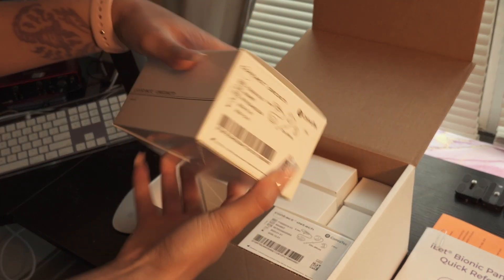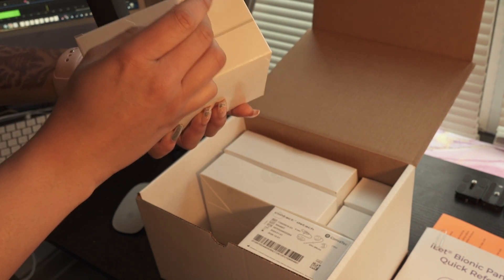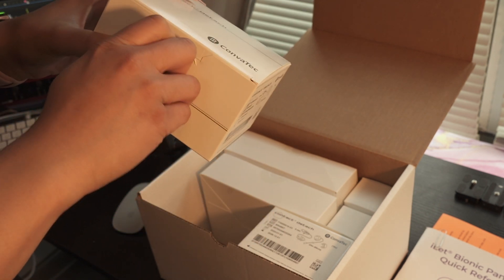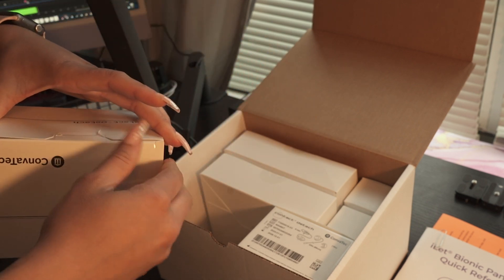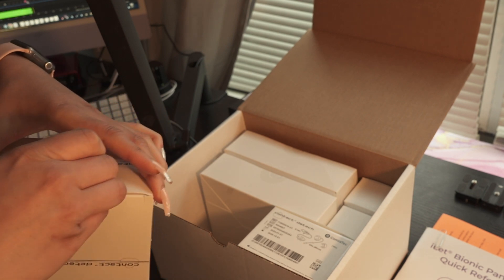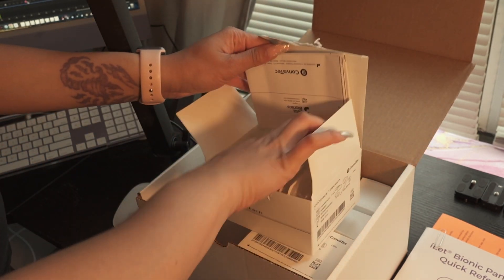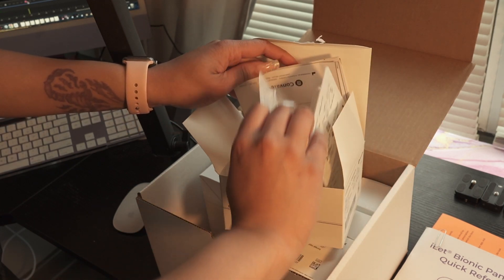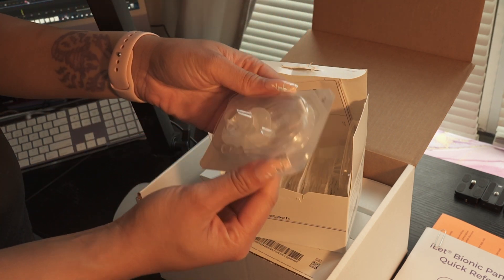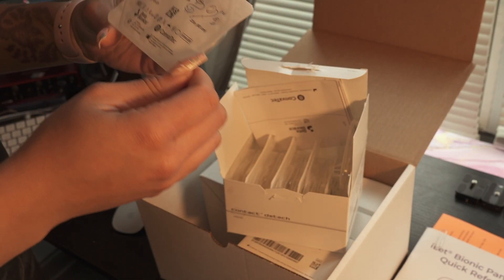Let's open this one. This is the thing that's going to be attached to me. It's not bad, not terrible. This is what it looks like.